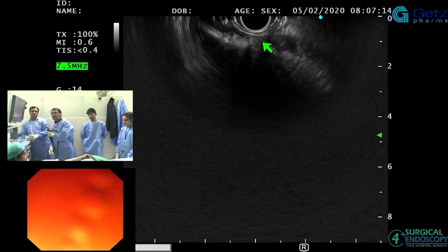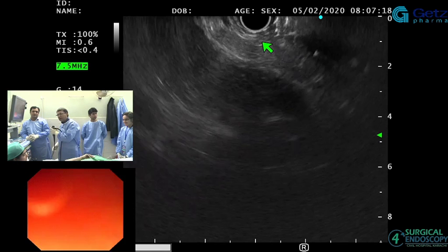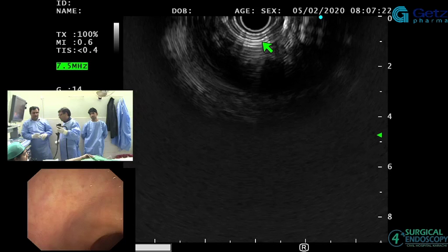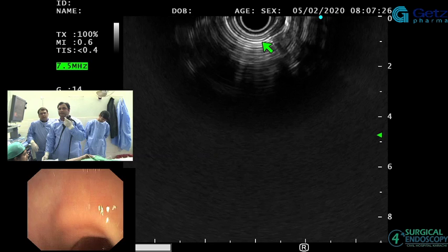What I'll do is I'll let you do that and then I'll explain. Okay, I'm going to come back because it goes straight to the landmarks. Okay, keep going. Deflate the balloon.